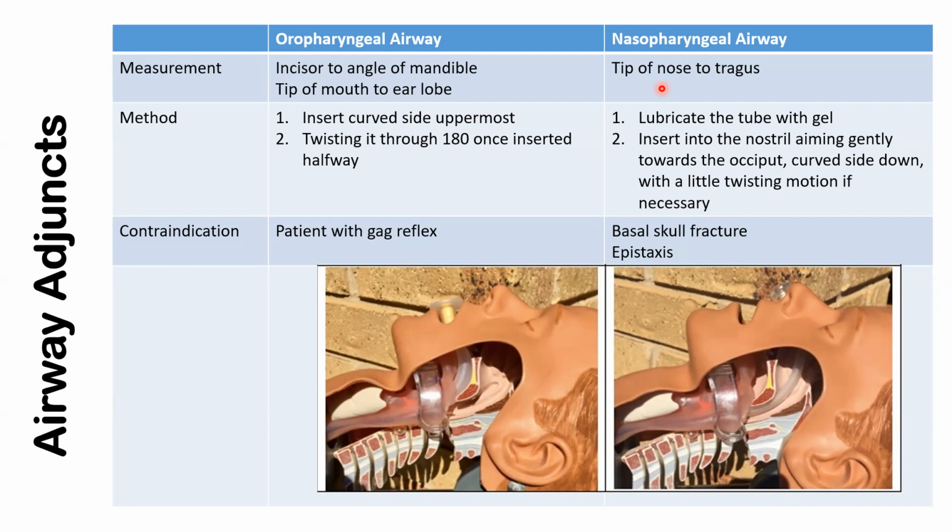When using a nasopharyngeal airway, we have to lubricate the nasopharyngeal airway. Choose a good nostril, make sure there is no deformity in the nostril, so don't use one with a deviated septum or something. Choose a good nostril, then you lubricate your airway.